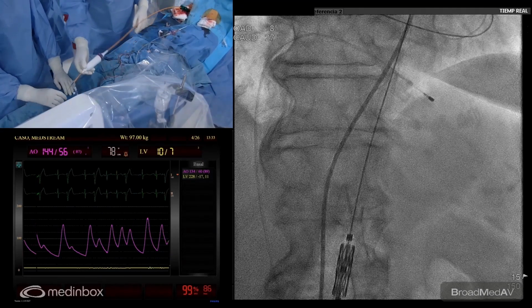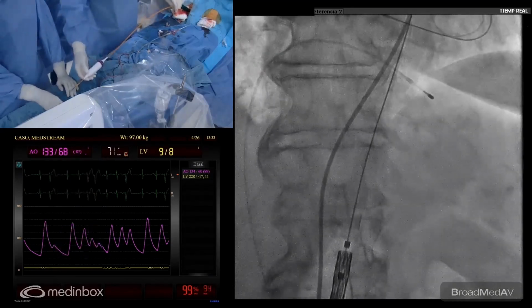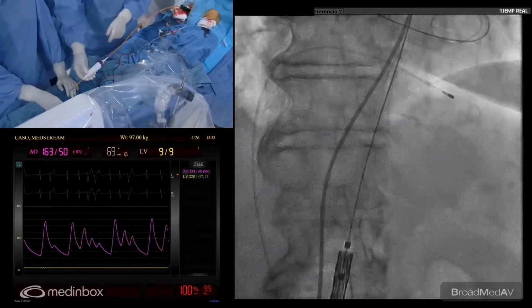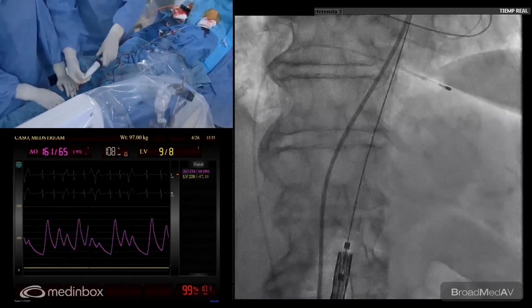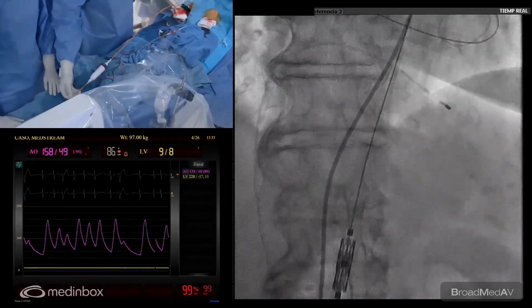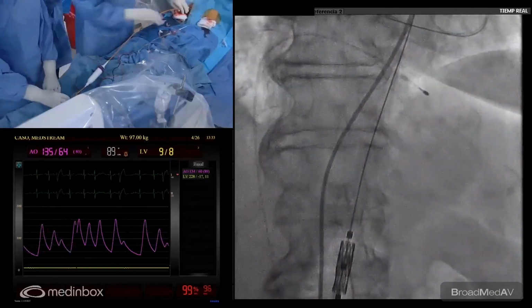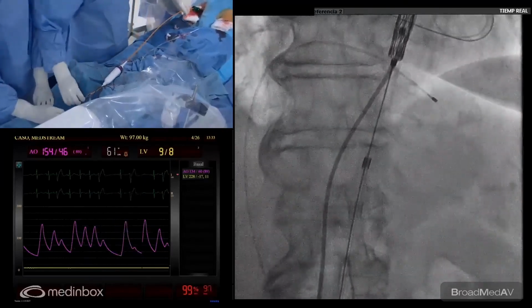First, we don't have to load the valve as we had to do with the other balloon expandable valve. And also the sheath is a deflectable sheath in the same way. Is that correct? Exactly. And do we have to pull here or something like this before delivering the valve, or no? No, we only have to advance. Okay. And before crossing the arch, we have to deflect 50%. Show me above.